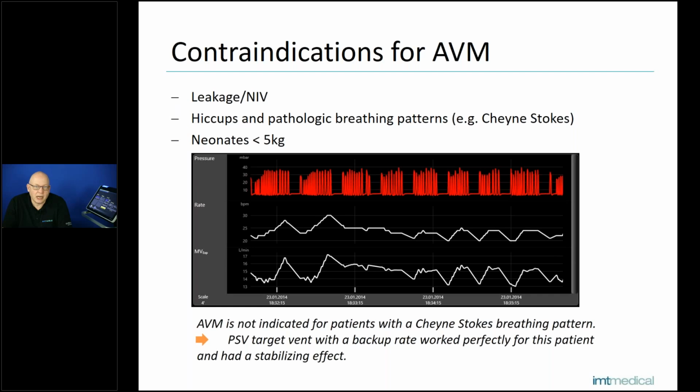So these are the 3 contraindications, but there's no contraindication regarding ARDS, COPD, or any other lung condition. Those all can be ventilated with AVM.